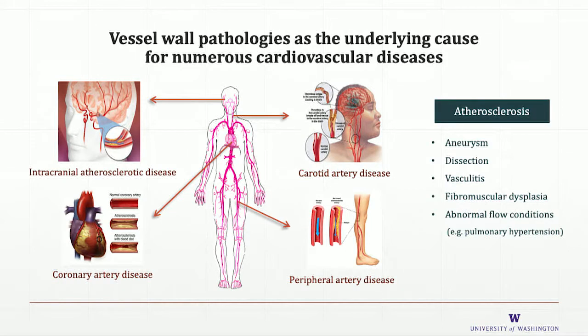The other thing I'd like to highlight is, even though vessel imaging started with a focus on atherosclerosis, its application has now extended into many different areas, especially in the brain. You can use vessel imaging to try to differentiate whether a lesion is caused by plaques or by other so-called vascular pathologies in the vessel wall, such as vasculitis.